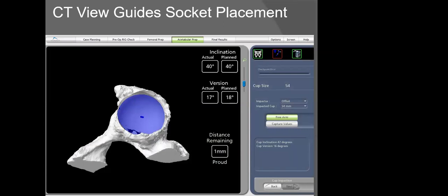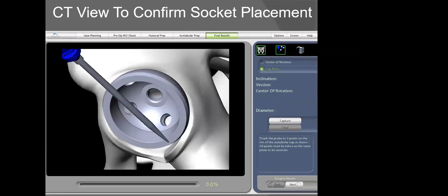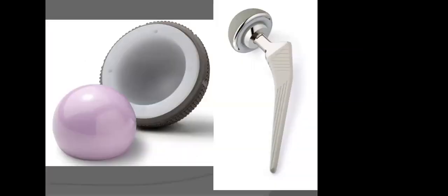We know in orthopedics that if we can optimally place both the cup, center of rotation, and the stem and the hip center, that we can maximize patients' function. Not only do we get the leg lengths perfect, we get the offset and distances for the muscles from the center of rotation perfect, so these muscles can function in their natural optimal configuration. The implants are much more durable with optimally positioned components. The hips are much more stable with optimally positioned components, and long-term durability is maximized as is function. Workflow checking the final positions of the implants as depicted here.